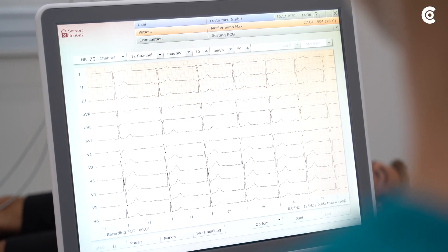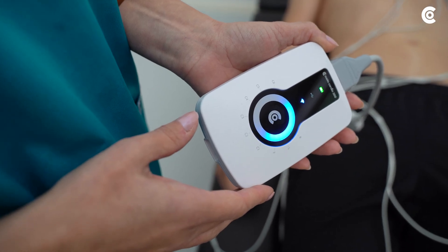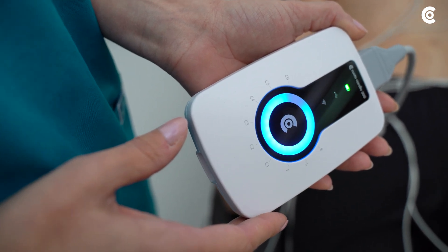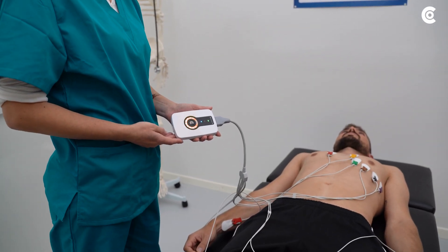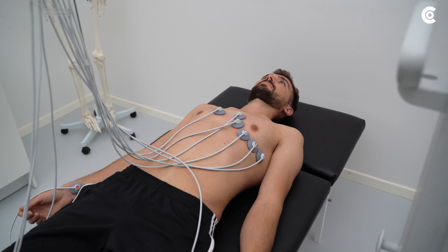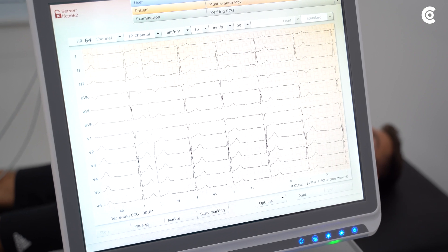Then start the measurement. With Cardio 300, you can do this by simply touching the button directly from the device. Once the recording has successfully started, the LEDs show the measurement progress in blue. If the LEDs light up in red, the electrodes are not placed correctly on the patient. Pay attention that the patient keeps calm during the ECG. The recording with CustoDiagnostic is not limited to 10 seconds.